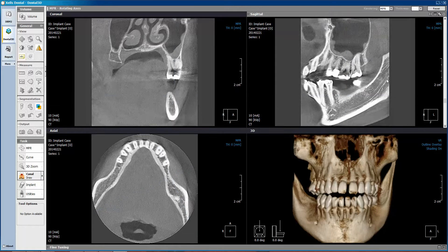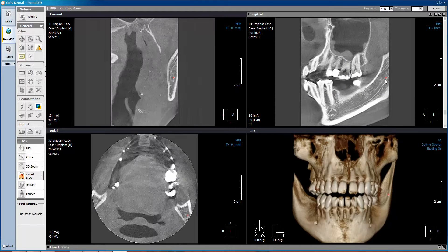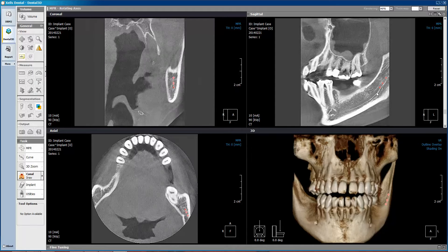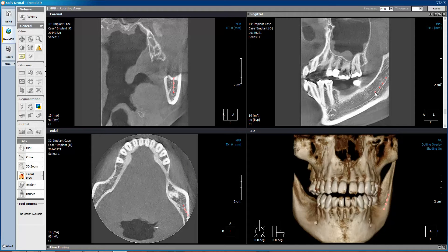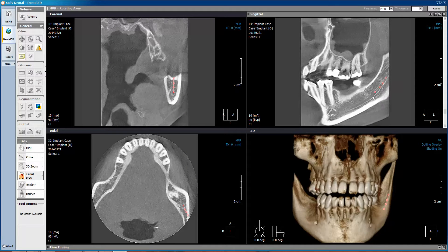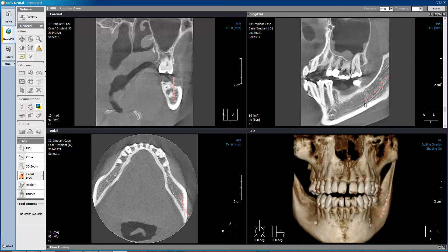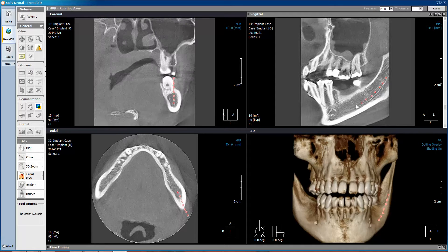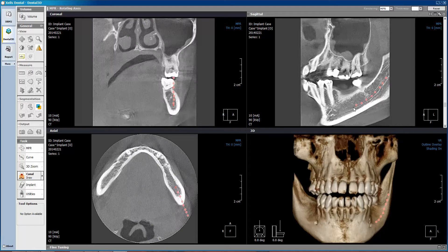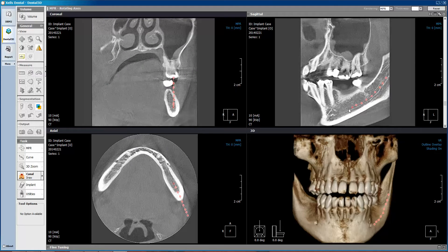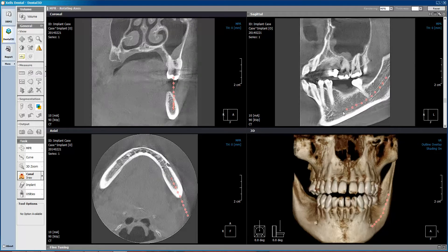Now every time we make a single left mouse click, it will begin to mark the nerve canal. I can also use the scroll wheel on my mouse to move buccal and lingual within the anatomy in order to better see the canal. I will continue single left mouse clicks to continue to mark the canal.